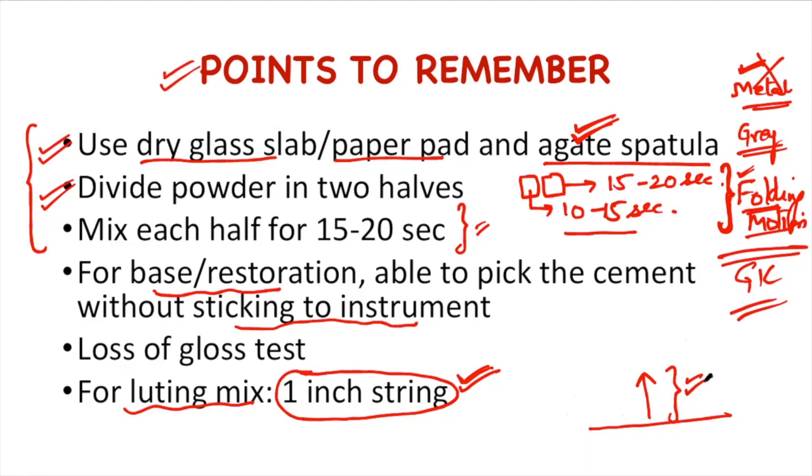One thing to remember when using the cement for base or restoration is the loss of gloss test. I will be explaining this when showing you the video of the mix.